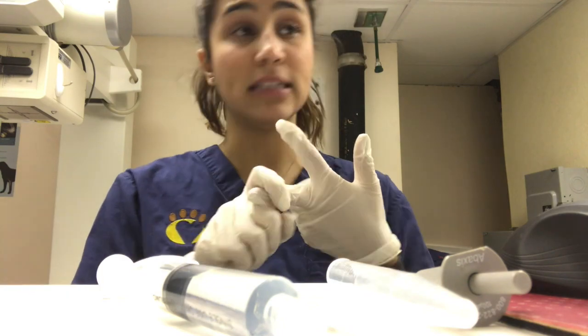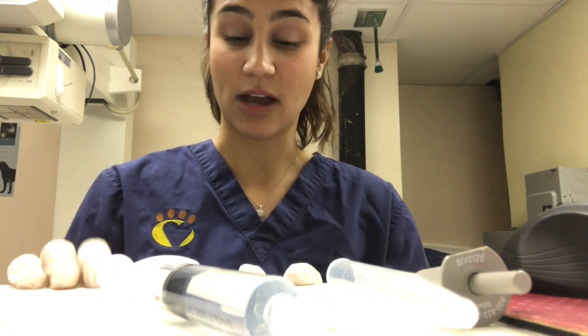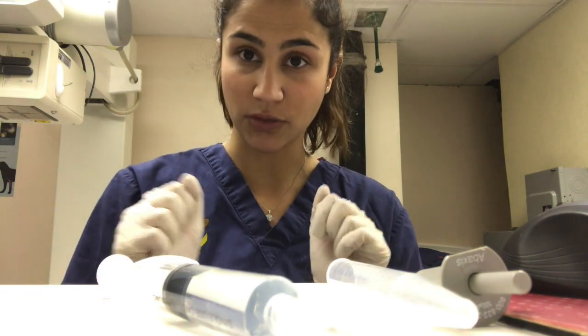Okay, so today I will be discussing a modified Knott's test. This specific test actually allows us to differentiate the different kinds of heartworms that are out there. The 2 different kinds are Dirofilaria immitis and Acanthocheilonema reconditum. So this specific test will help us identify each different one when we're looking under the microscope.